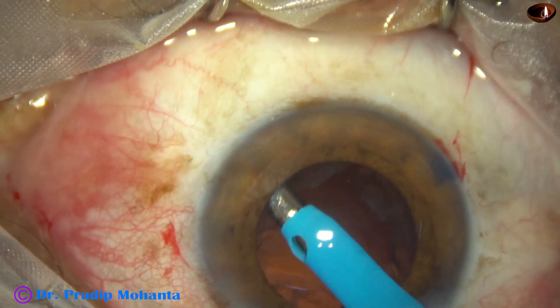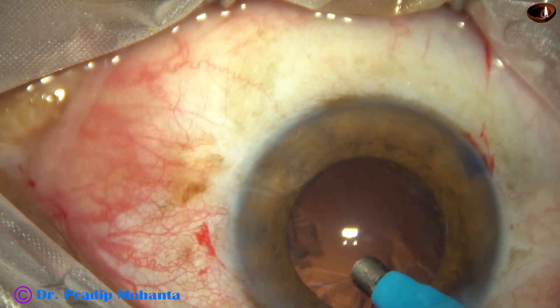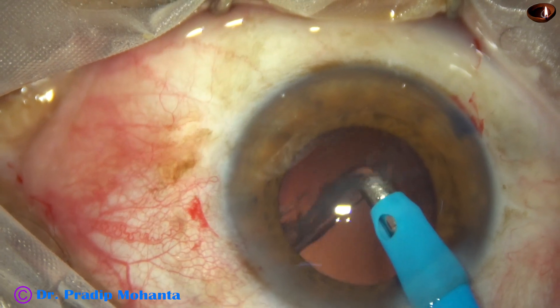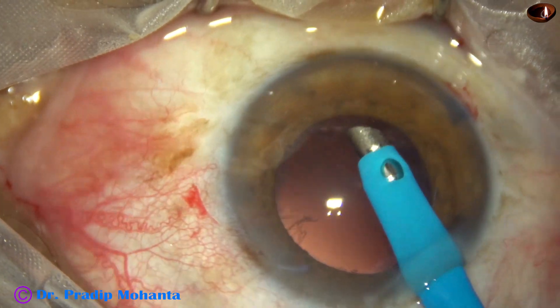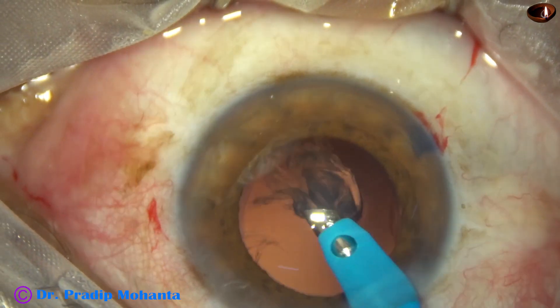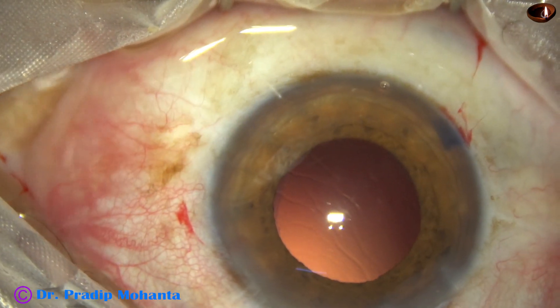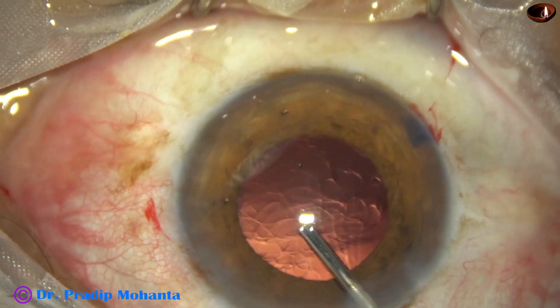And now I am trying to remove the cortex by the feco-needle itself. This maneuver should not be imitated — do whatever you feel safe in your hands. I felt safe to do this in this case, but if you do not feel safe, do not do this. I have removed the cortex 360 degrees by the feco-needle itself in this case.